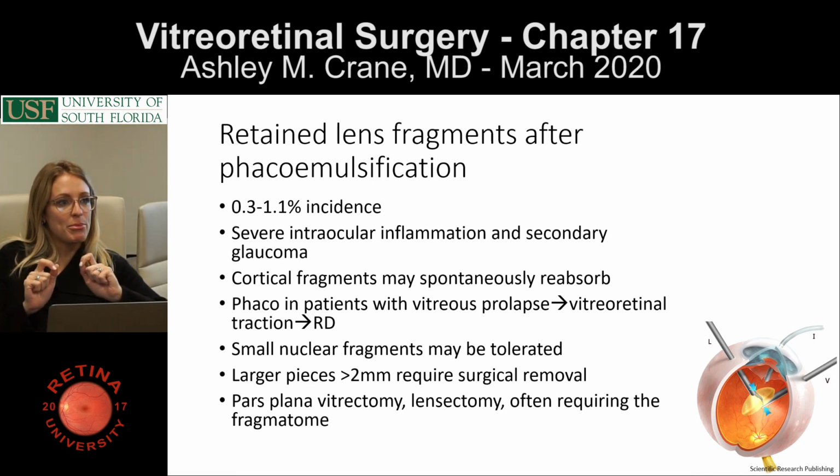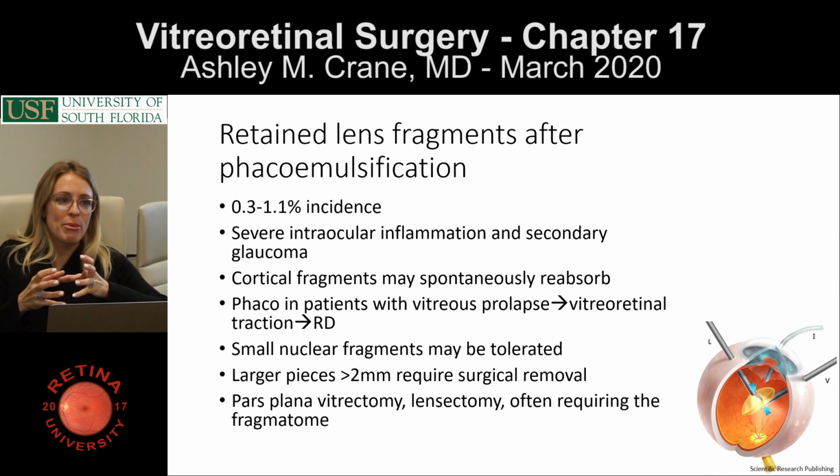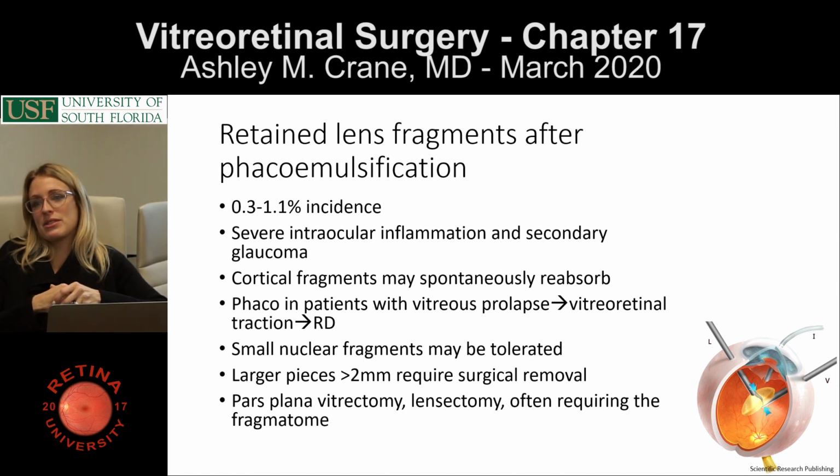People don't remember that when we're inserting our trocars, you're putting a lot of pressure on the globe, and those wounds will just open right back up. So close all your corneal wounds, just to help the next person down the road, and refer quickly. Don't think, oh, maybe that 4mm nuclear fragment will resolve and I won't have to send this out. It's just better for everybody to get them sooner.